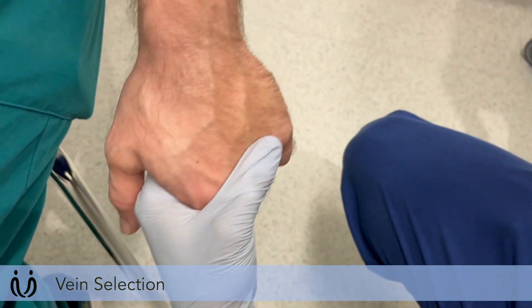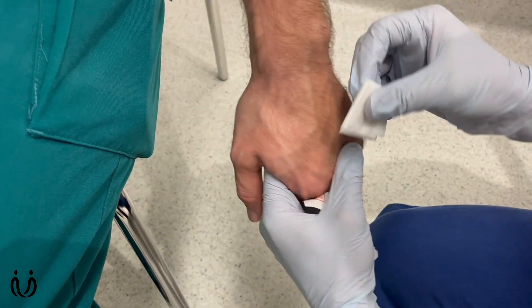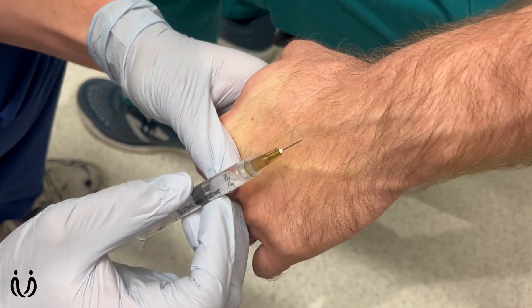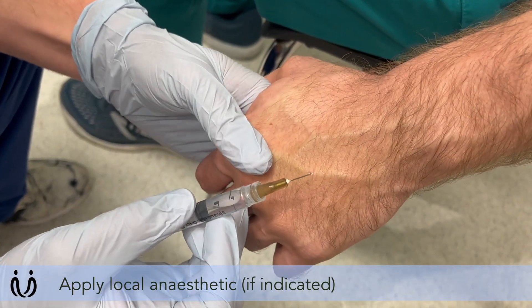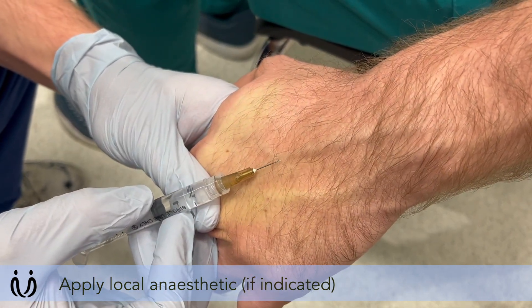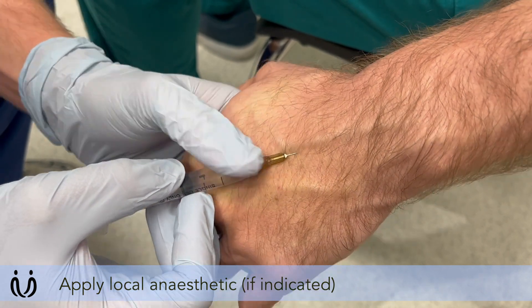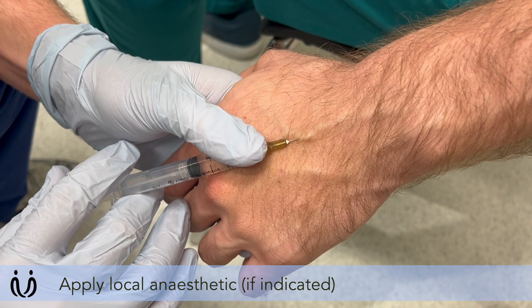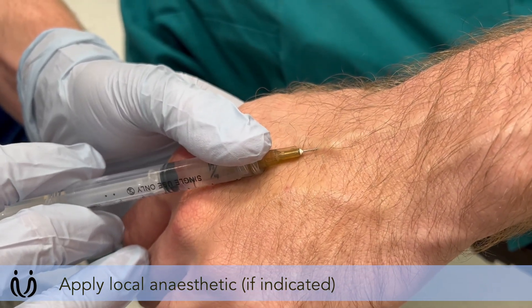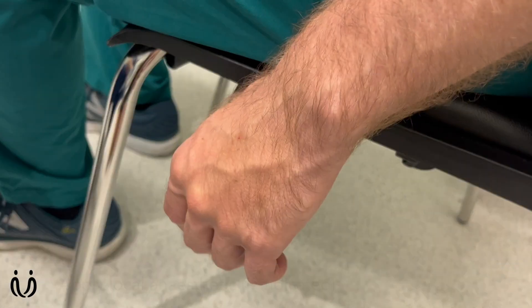Having a look at the hand, there are a couple of nice veins. I'm going to swab that area to make sure it's nice and clean, then place some local anaesthetic just next to the vein. I'm placing the brown needle right next to the vein — one, two, three — stabilizing, and placing a little bleb of local anaesthetic subcutaneously just next to the vein to anaesthetize that area. I'd recommend giving it around 30 seconds to a minute to work appropriately.